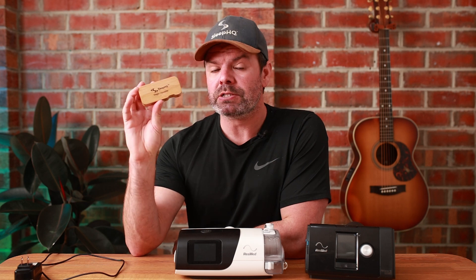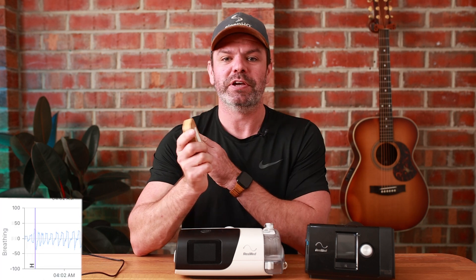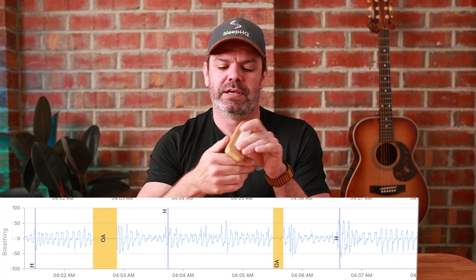This is almost real-time data — there's a 10-minute lag. You can hop into bed, put your mask on, start breathing, and in 10 minutes click refresh on your Sleep HQ account, and you can see every single breath you took over the last 10 minutes. How cool is that?